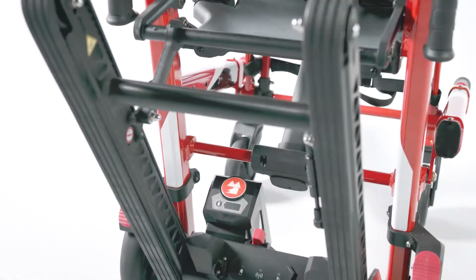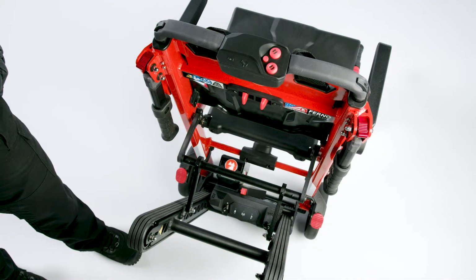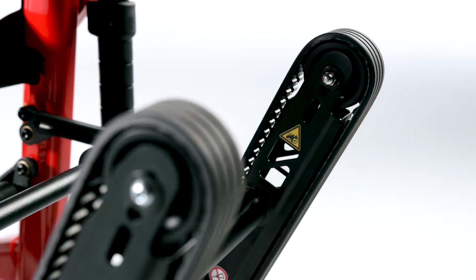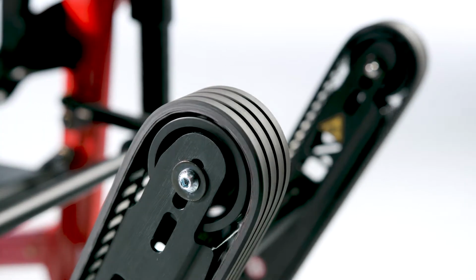After a period of inactivity, the chair will enter sleep mode to conserve battery power. Tap any button on the controller to wake the chair from sleep mode. Allow a few seconds for the wireless connection to be established before using the chair.